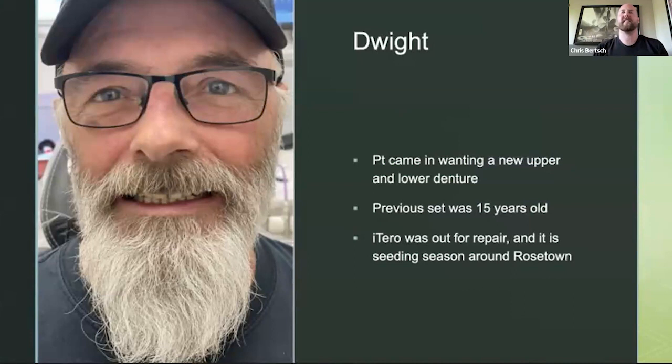I've heard of denture replicating machines that you use with alginate, but I've never seen one and we don't have one. So this is the process I use so that I can still keep it to as minimal appointments as possible.